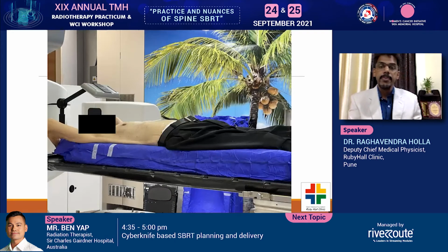This is a typical immobilization we use in our hospital, with the full body immobilization system, the Vac-Lok. The patient is lying comfortably with that.